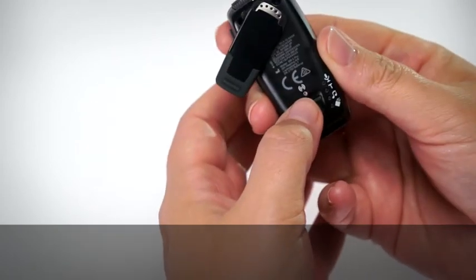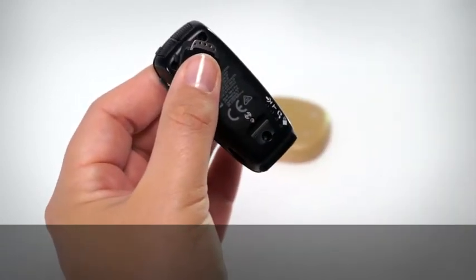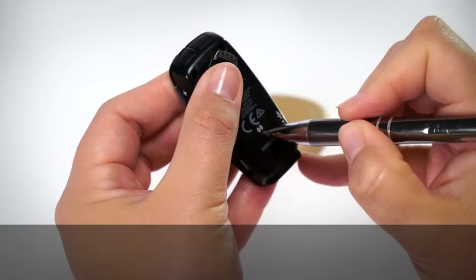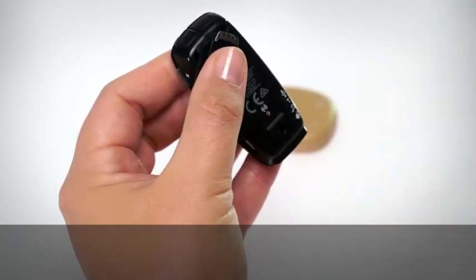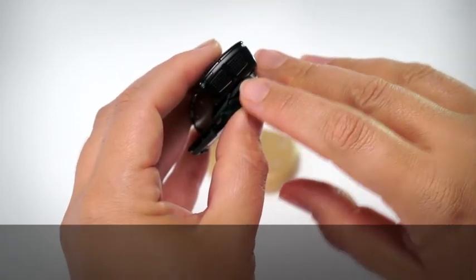Use a pen to press the pairing button once. The light on top of the Mini Microphone 2 Plus flashes orange for 20 seconds.